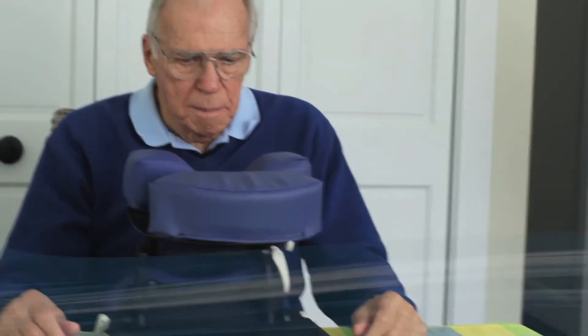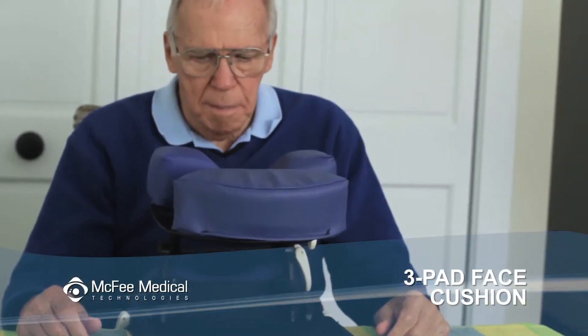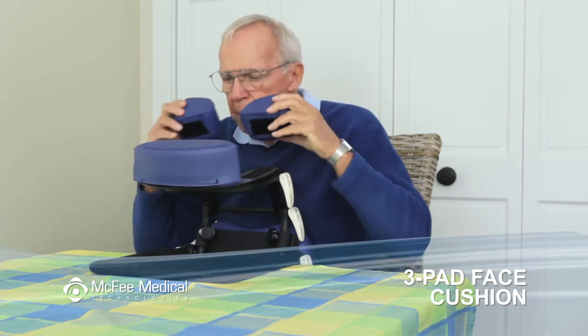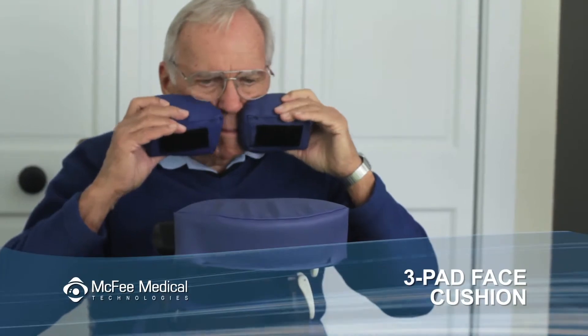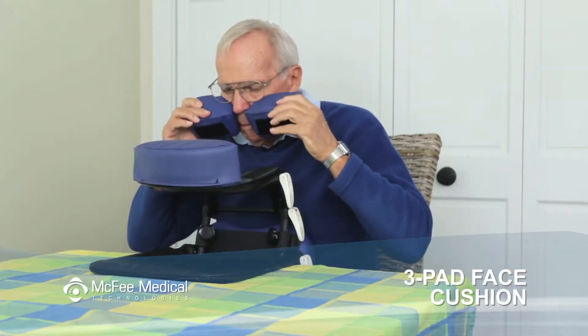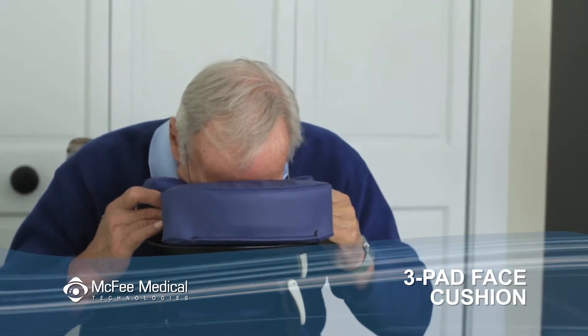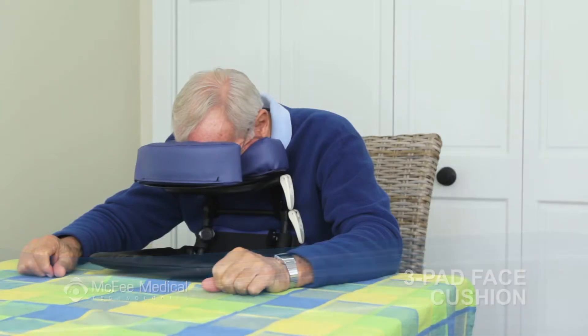Remove the crescent face pad from the face rest platform and replace it with the three pad system. Now remove the two cheek pads and hold them up to your face while wearing your glasses or eye patch. Hold the cheek pads in a position where they do not interfere with your glasses or eye patch. Lean over the face rest platform and settle the two cheek pads in place until the cushions are in contact with the velcro on the face plate.